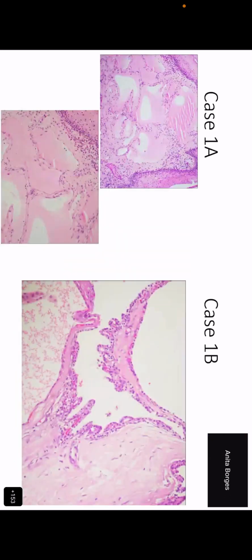Let's see. Suveta and Sumeta, yes, ma'am, they think that this is an epithelium. What do you think is in 1A, actually an endothelium? There is no discrepancy about 1B. Now, Sumeta, will you explain to them why they are wrong?